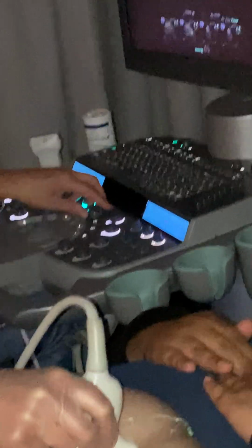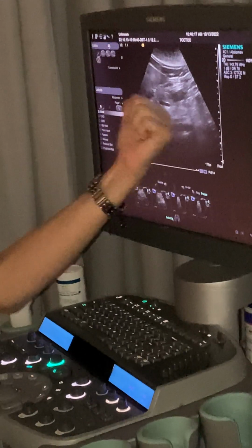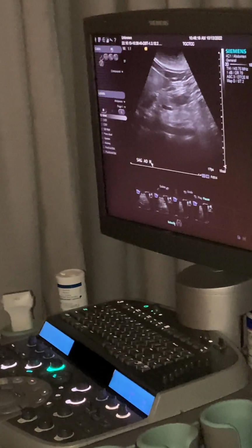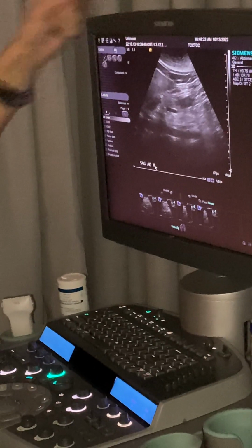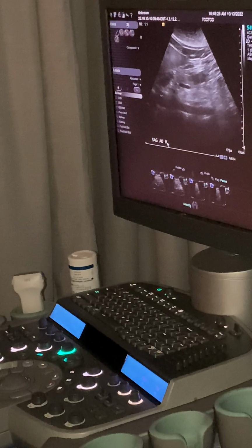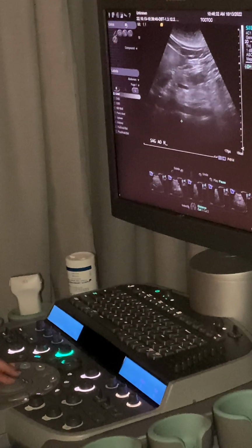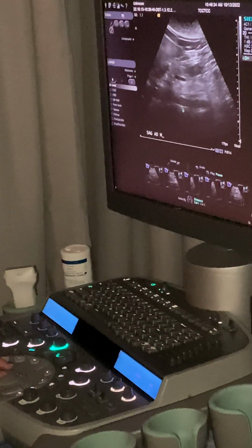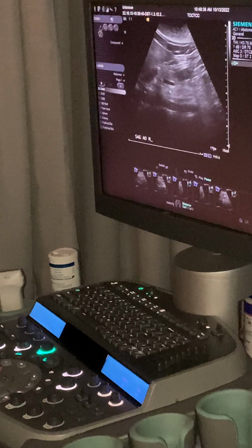We see splenic vein. Portal splenic confluence, and confluence transverse. So SMV, IMV are coming in this way. This thing's going this way towards the portal hepatis. It's going that way towards the splenic vein and panc head. Okay, so Sag AO mid. Take our image, calipers. I've got some clean wall right in here to measure. We know that we're at mid because the SMA intersects with the pancreas, and we're at pancreas.